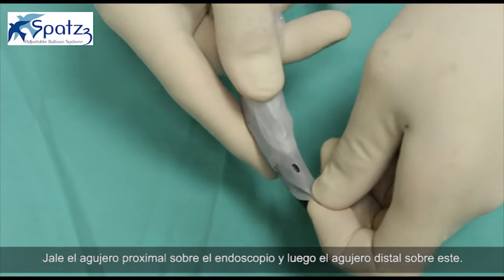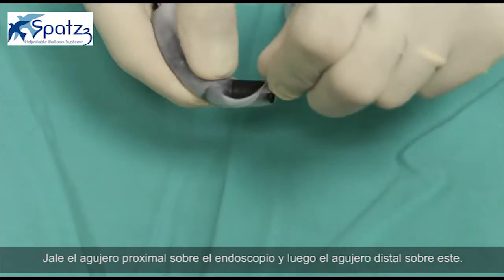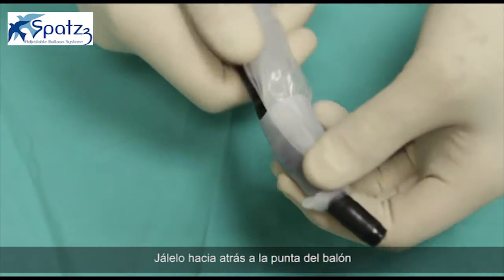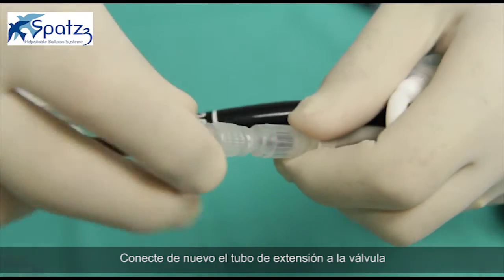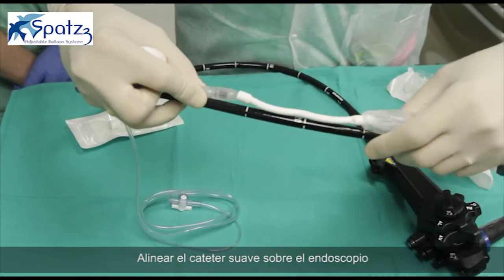Pull the proximal hole over the scope and then the distal hole over the scope. Pull it all back to the balloon tip. Reconnect the extension tube to the valve. Align the soft catheter along the scope shaft.